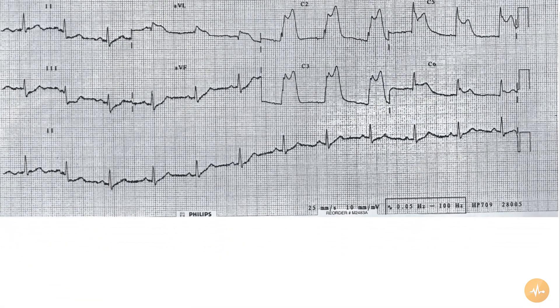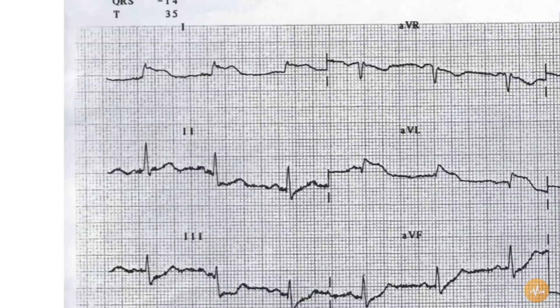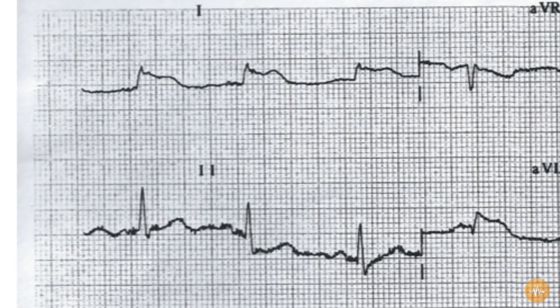The rate is 75 beats per minute. The rhythm is normal sinus rhythm. The axis is normal, with an up-going complex in lead 1 and 2.